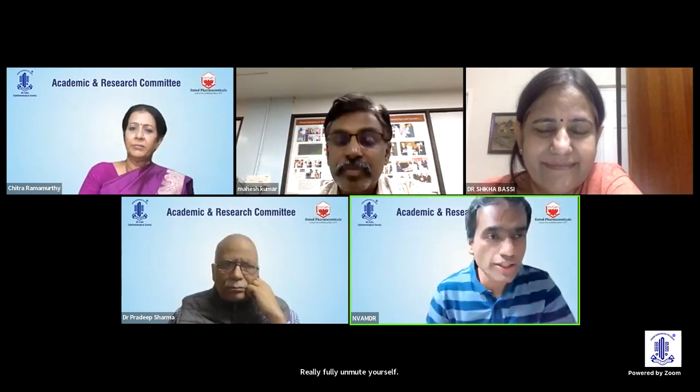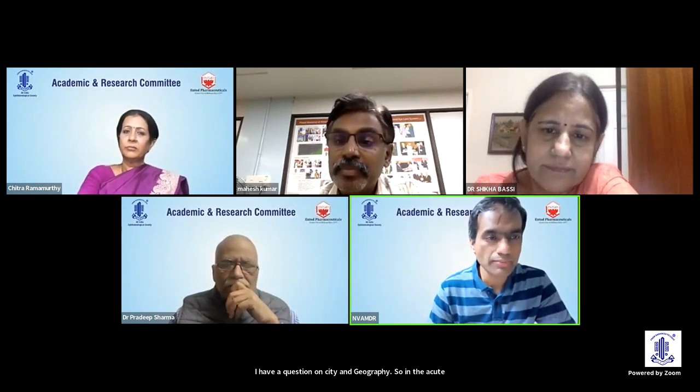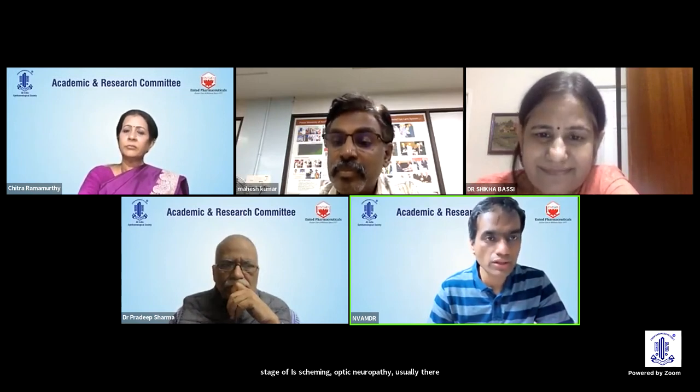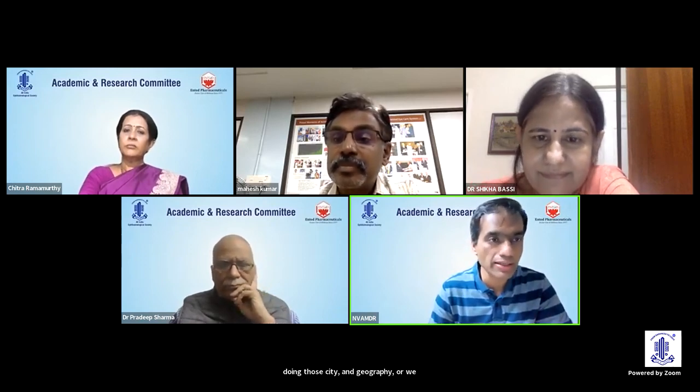I have a question on OCT angiography. So in the acute stage of ischemic optic neuropathy, usually there will be some edema. So do we wait for some time before doing the OCT angiography, or would you recommend a serial OCT angiography? What do you do in your clinical practice?